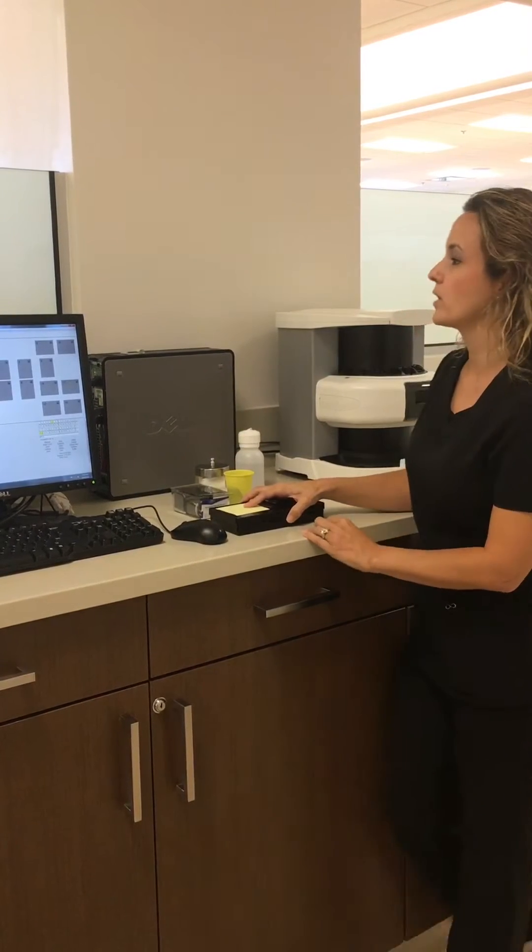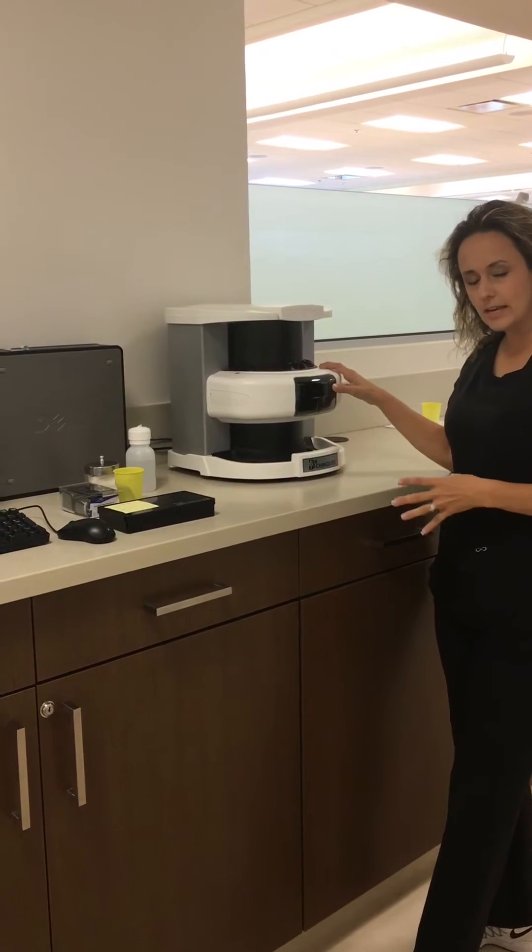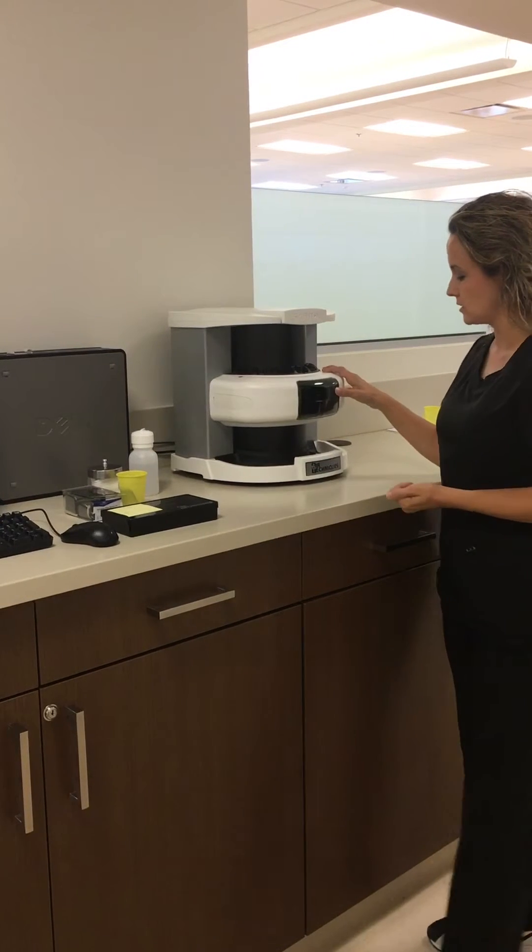The left side of the clinic uses the ScanX scanner. We have one that will scan four images at a time, and it will scan an FMX in just a few minutes.